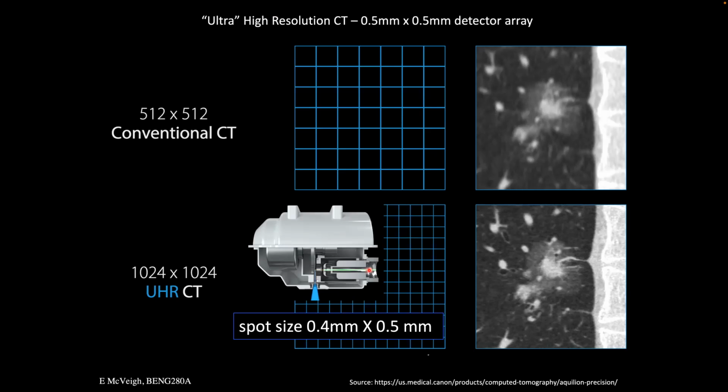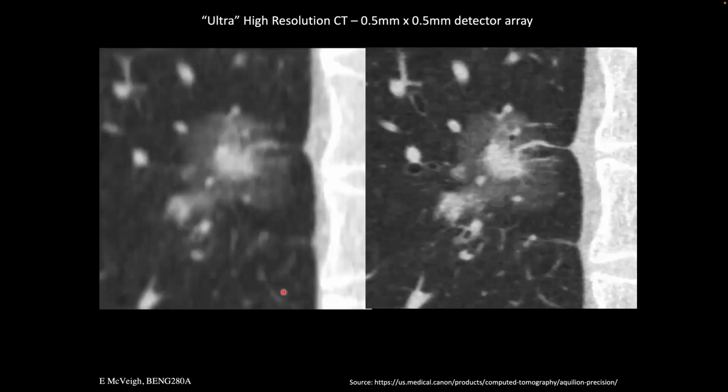Principally, this scanner is really great for lean, thin people, because you're going to be limited in the number of X-rays you can produce with something like that. But it certainly shows a difference in practical spatial resolution, not just phantoms and bars and full width at half max and all that. This picture is a lot blurrier than this. In some places in the body, this and this might have looked the same, because this just blurred through normal motion of physiology.